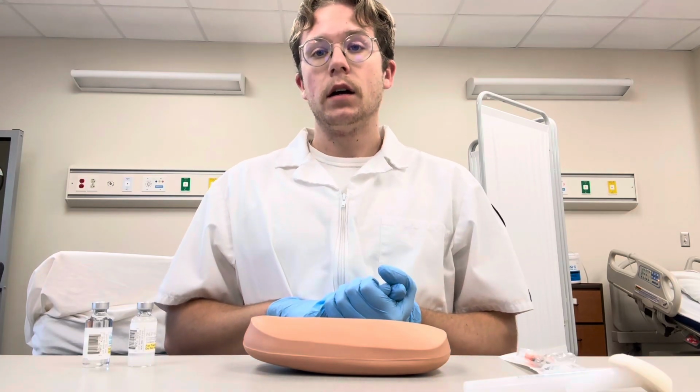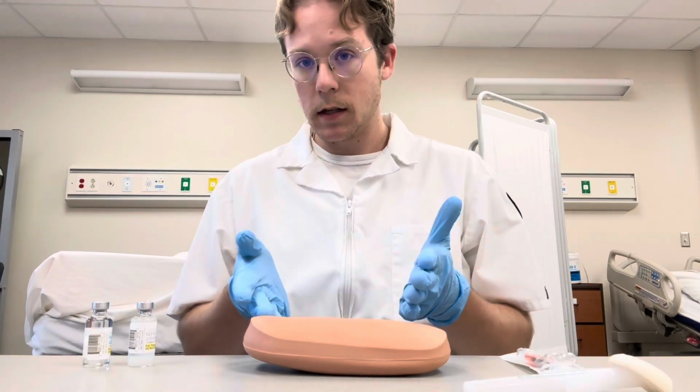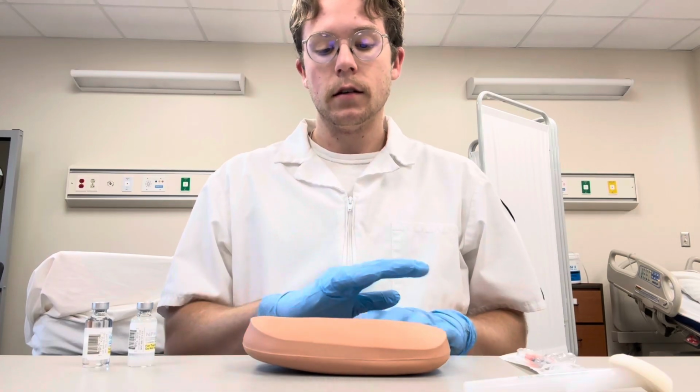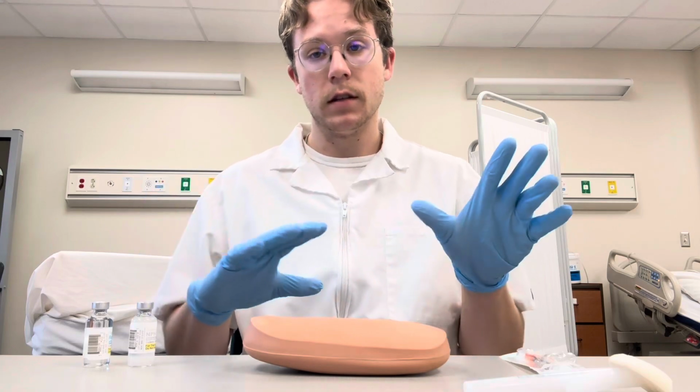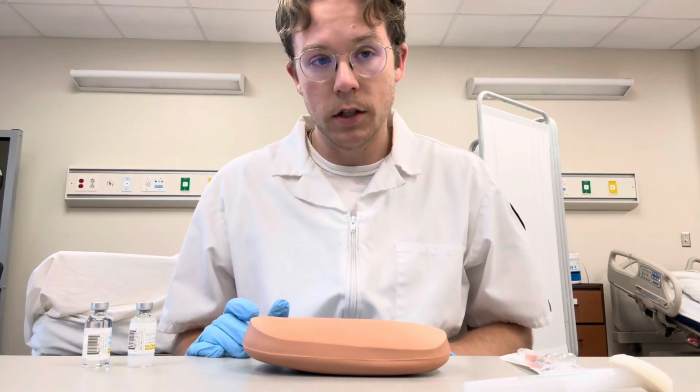All right, and we will also continue our focused assessment by looking at the previous injection site, and looking for signs of bleeding, infiltration, infection, things like that. And then we'll rotate to another sub-Q injection site.